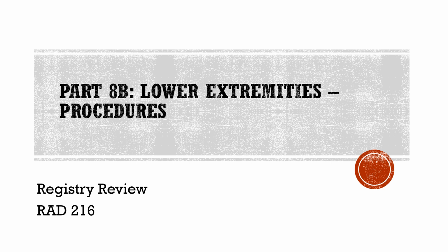Hello, this is a video lesson on the procedures for the lower extremities continued part B.